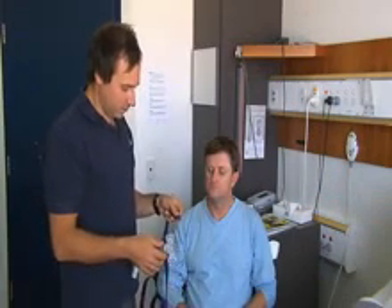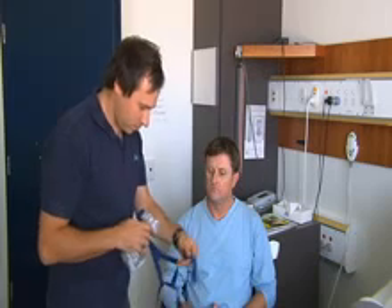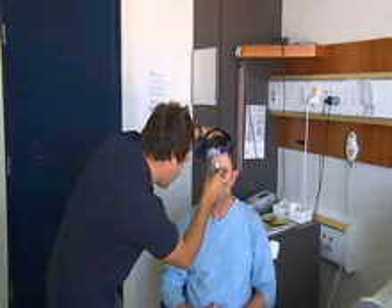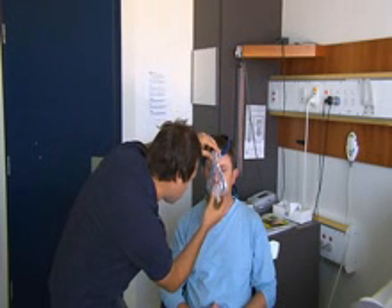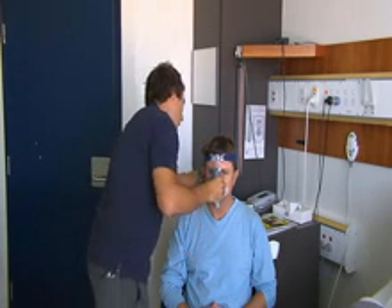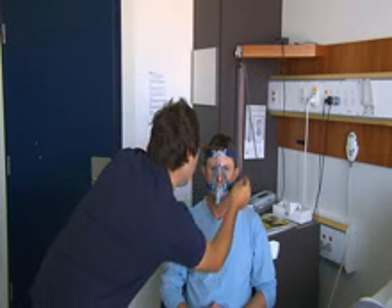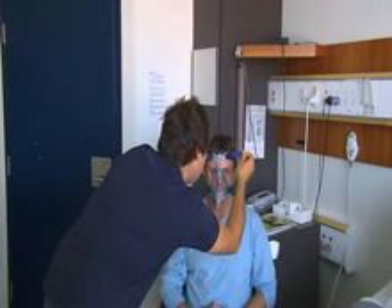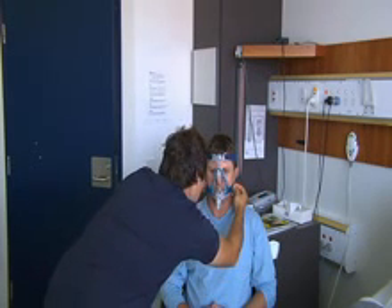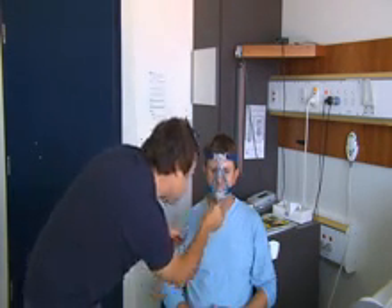You've been prescribed either a full face mask or a nasal mask, depending on which type provides you with better ventilatory support. During your education session, the nurse will set up the mask for you. Fitting a full face mask: a full face mask covers both your mouth and nose. For this demonstration, we'll be using the commonly used Quattro full face mask. Ensure the mask is assembled correctly — refer to your manual. Attach the top two straps of the headgear to the forehead support. Place the mask on your face symmetrically — you can use a mirror to assist you. Pull the headgear over your head and clip the lower straps into the mask frame. To ensure a good seal, make sure the full face mask is not too close to the corners of your eyes or too low on your chin.